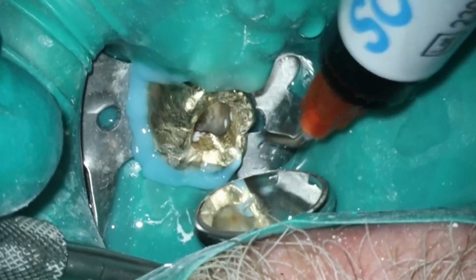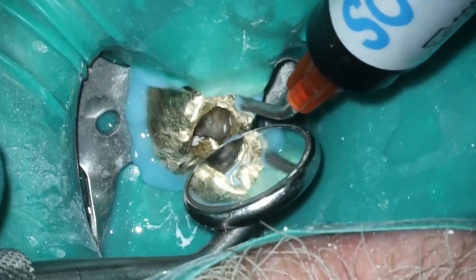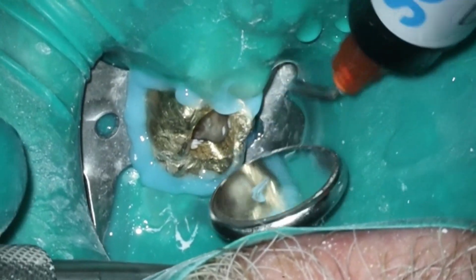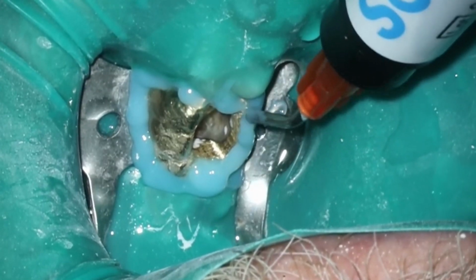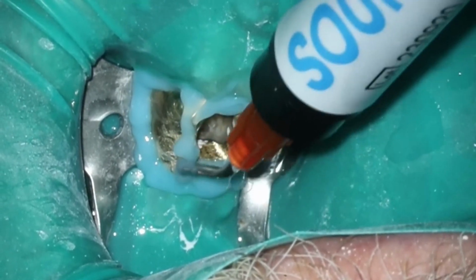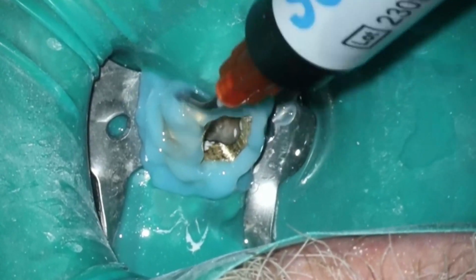By the way, there have been no cuts made to this video as normal. All the cuts that you see are just so that it will stabilize, because the footage is very shaky. You can kind of tell by his tongue. He's moving quite a lot here. Once again, had some anxiety, but he had driven from so far. He didn't want to come back on meds. I did offer it, and he kind of just powered on, and very good on him on that.